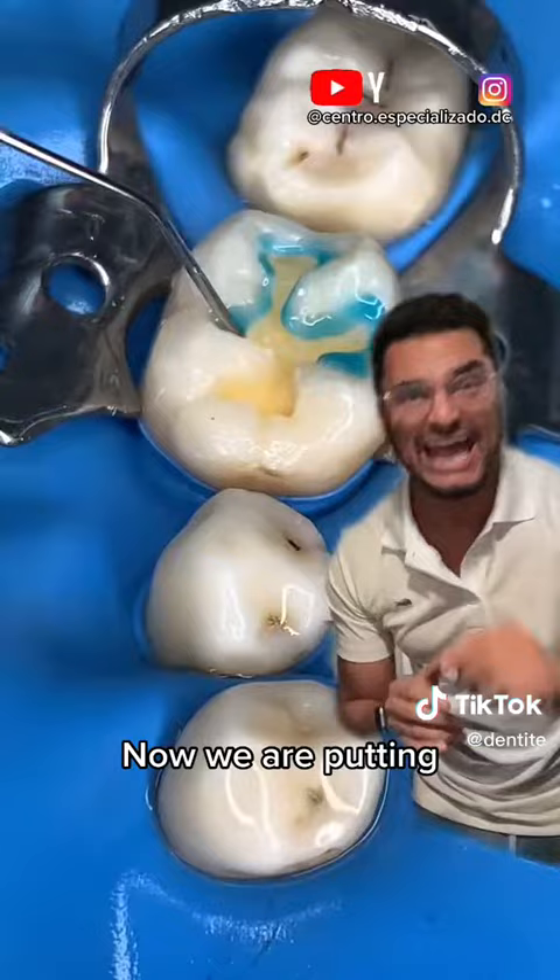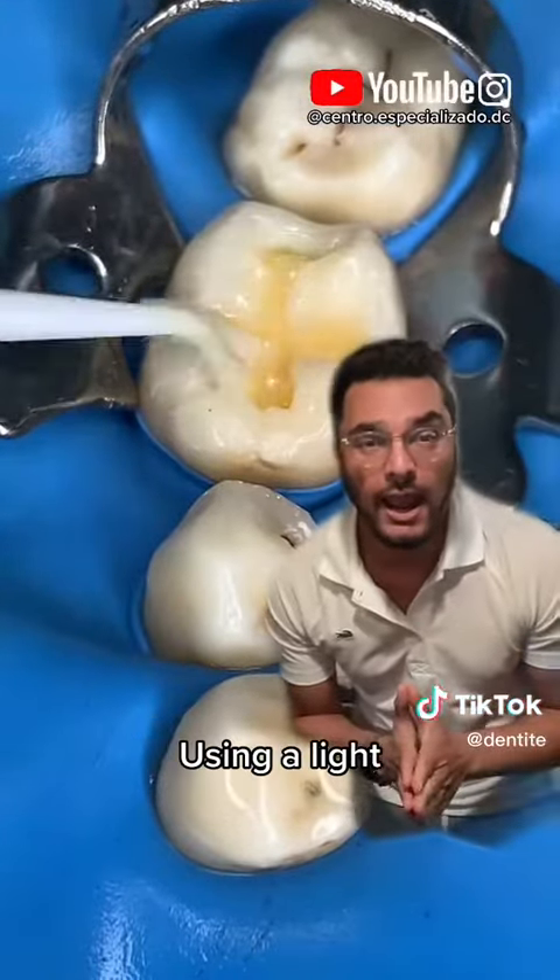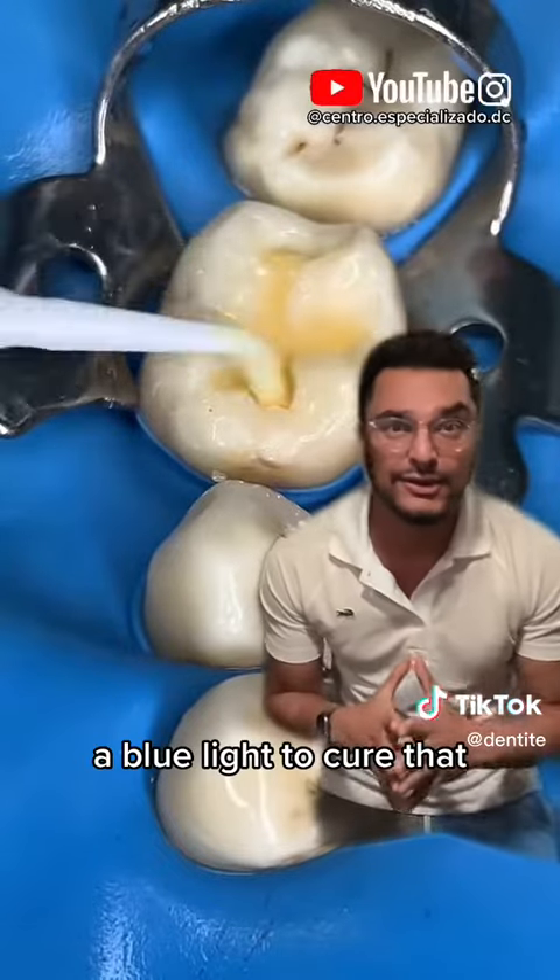Now we are getting it ready for the white filling. We're etching, bonding, placing bond, using a blue light to cure that.